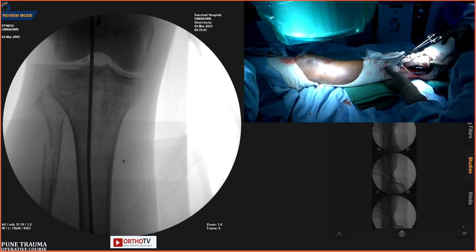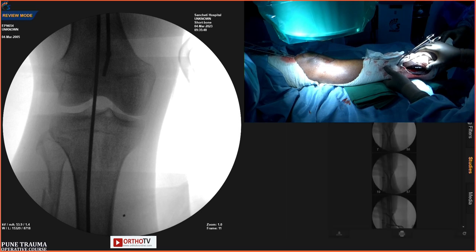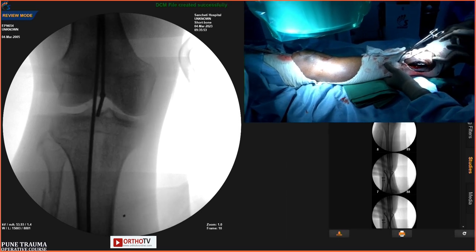You can appreciate, shoot. The entry point. Is it perfect? This is good. Shoot. Yeah. Okay, Chetan, please show the ankle. Ankle center.